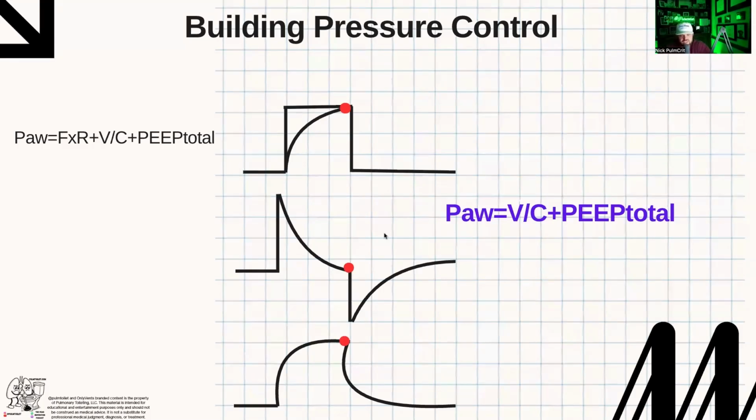That's a key point, because what we hear often is the driving pressure, is this delta pressure. Theoretically, it's your PEEP, and then your plateau becomes whatever the delta is. But that gets morphed into that's your driving pressure. But if the patient's not passive, then that's not the driving pressure that we think of when we think of driving pressure less than 15, because the patient's active. So you don't know what the driving pressure is because you don't know what the alveolar pressure is, because there's still flow. So the alveolar pressure could be anything, right?